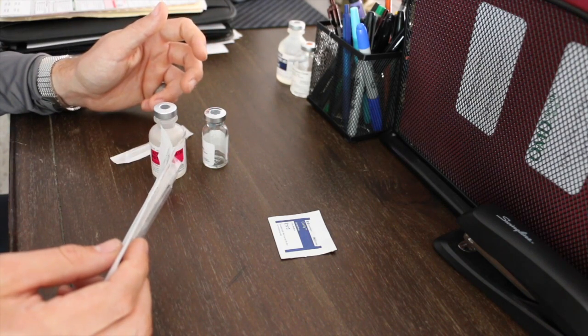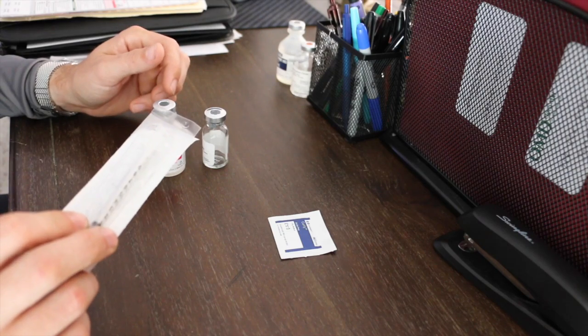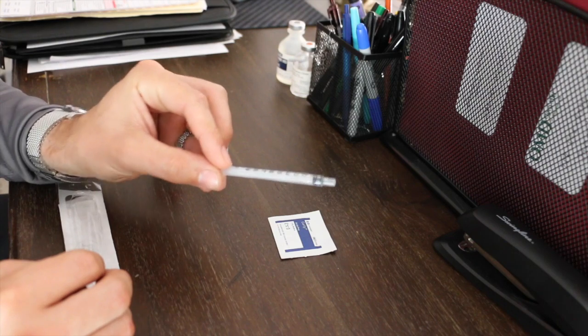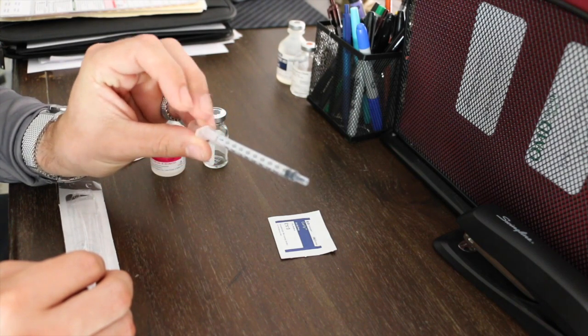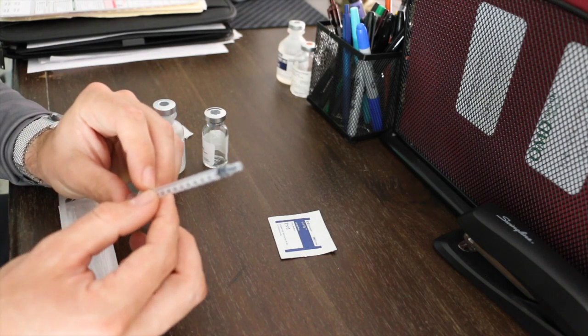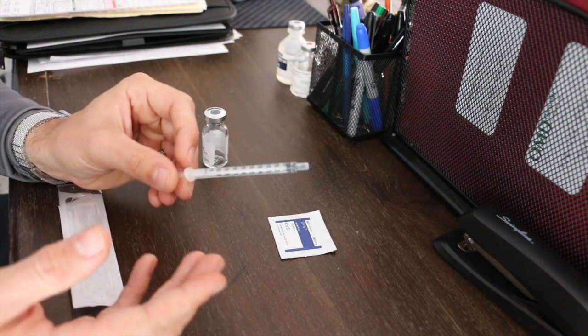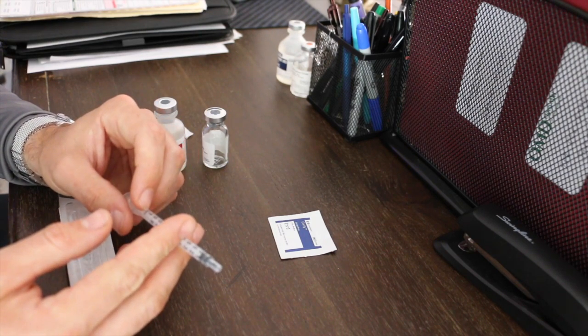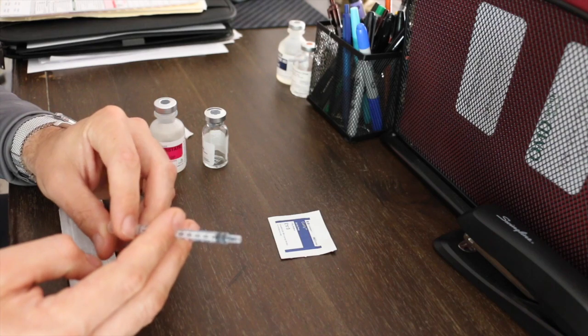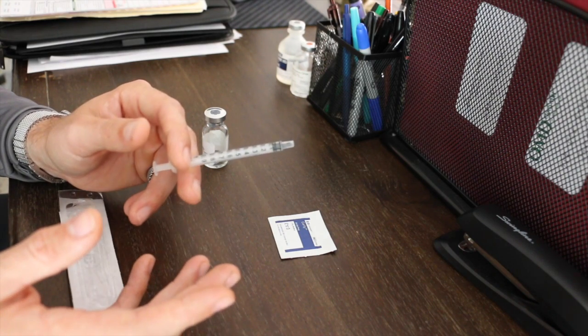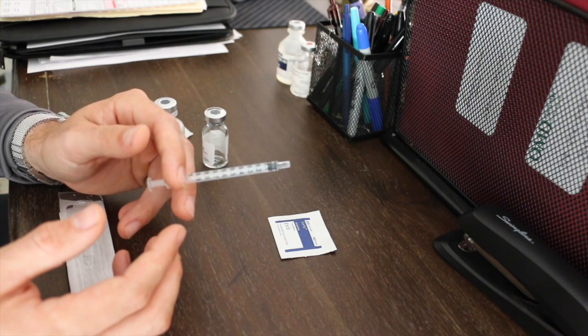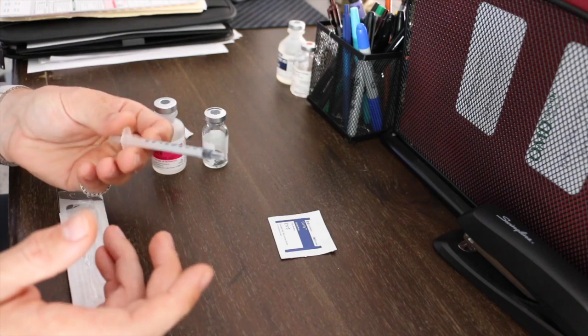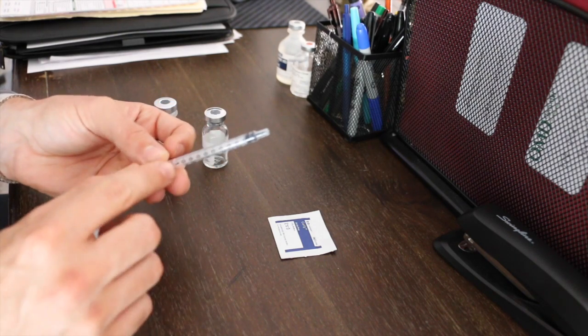This is a one ml syringe. It has tenth marks all the way up to one ml. One ml and one cc are the same. If your prescription requires two, three, four, five or six ml, they should provide you with either a five ml or 10 ml syringe. You shouldn't have to pull six times with this, but worst case scenario, if you need five ml, you would just pull five separate times up to the one ml mark.